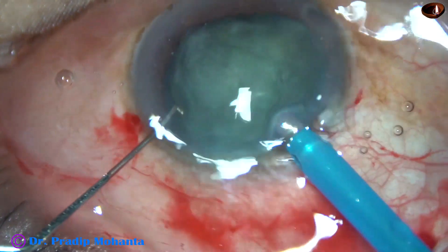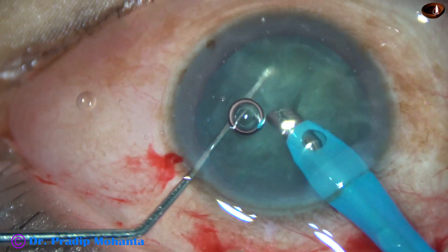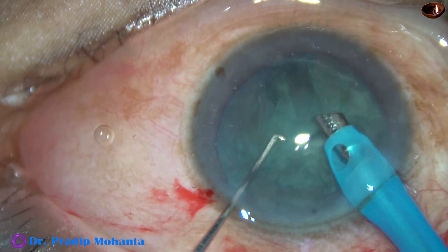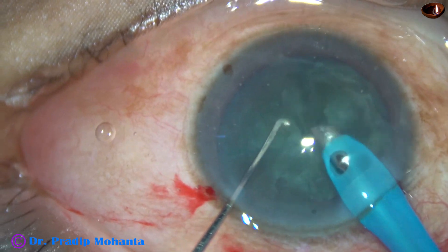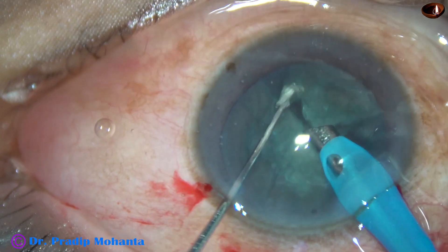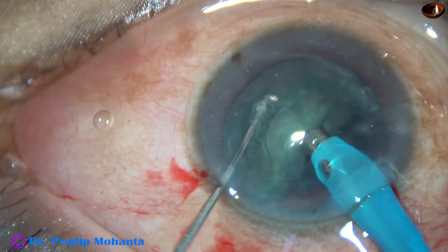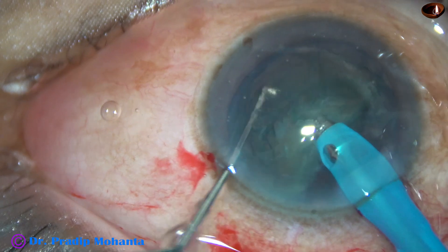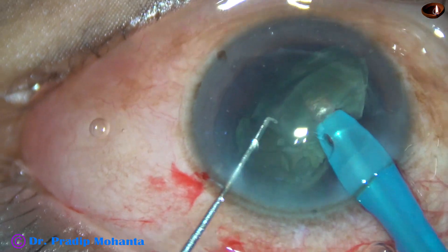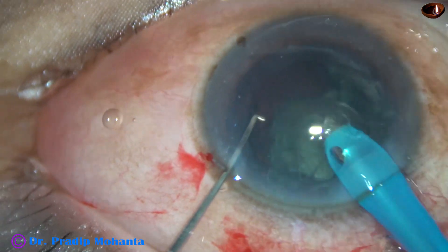In the left hand is a chopper designed by me — it is just a bit stouter than a Sinski hook. Now this piece is emulsified, and then the other small piece. Then we come to the hemi-nucleus, and it is divided into two pieces. This piece is emulsified, and then the last piece.